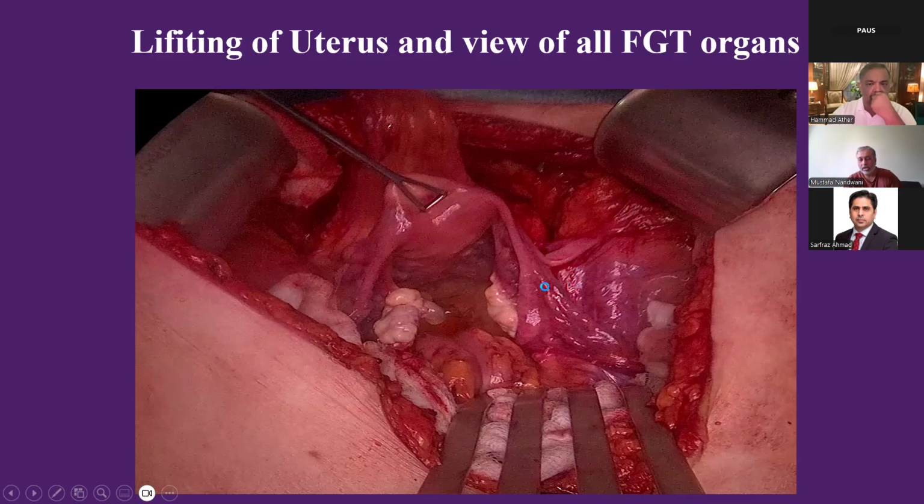So these all need to be cut, and underneath there will be the gonadal vessels, which we need to cut because in females we need to take out the uterus, fallopian tubes, ovaries, and a part of the vagina. So that's called the anterior pelvic clearance. However, currently there are options of vaginal sparing and uterine sparing, depending on the age and requirement of the patient.